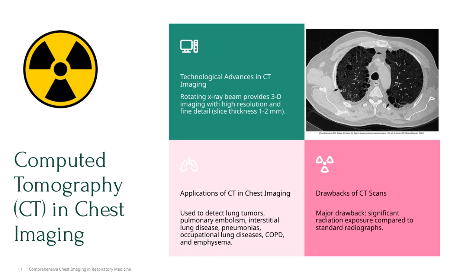However, while CT scans offer these powerful benefits, they do come with some drawbacks. The major concern is the exposure to significant radiation, which is higher than what we get from standard chest X-rays. This increased radiation dose is something we need to consider carefully, especially when ordering multiple scans or for vulnerable patient groups. So, while CT is a fantastic tool in our imaging arsenal, we must balance its diagnostic advantages with the potential risks associated with radiation exposure.